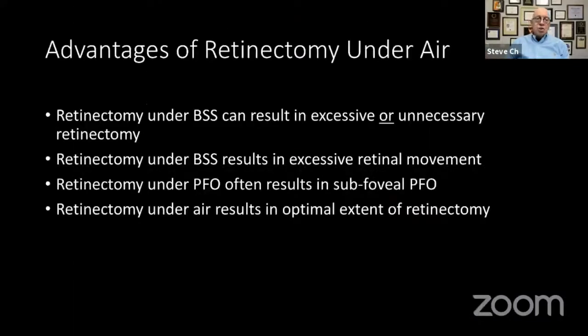Bad idea. What's the advantage of retinectomy under air? You do just the right amount. If you try to do it under saline, you may do retinectomy when it's not required. Often I'll think, well, I need retinectomy, then I'll do internal drainage and fluid air, and it turns out I didn't need it. Other times you can do unnecessary or excessive retinectomy.